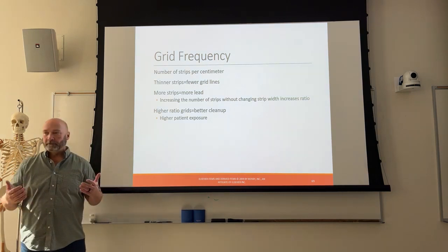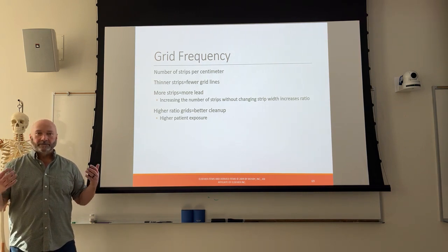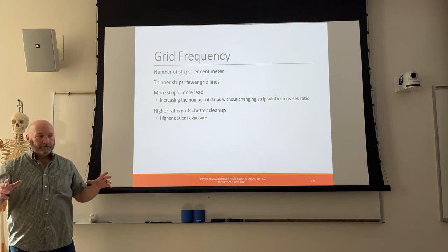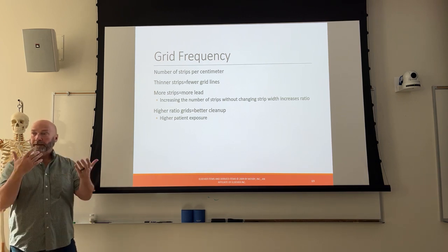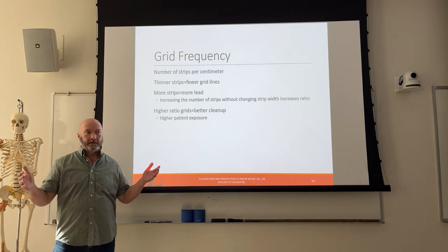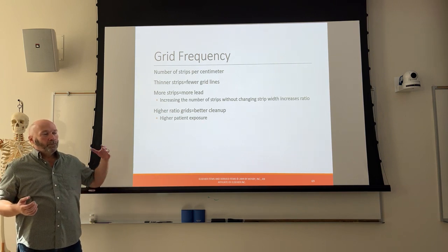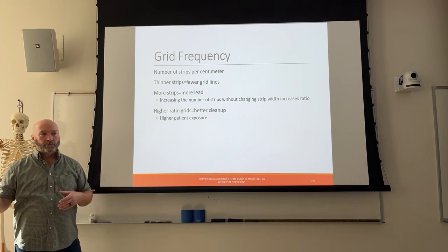So if you have two different things, especially electronic, two different things that have similar reconstruction patterns, you're going to have that. So when you're out shopping for a TV, what are you looking for? You look for bit depth, right? How many colors can you see? But what's the other thing that you look for? Pixels, resolution. It's a matrix. So what you're looking for is small pixels in a large matrix, right? So big numbers, right?